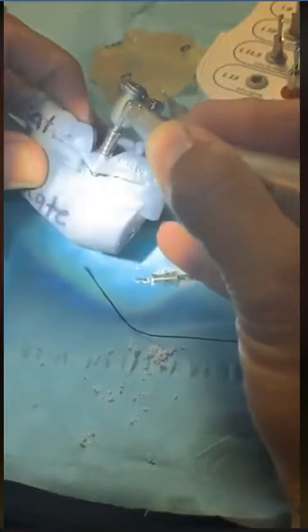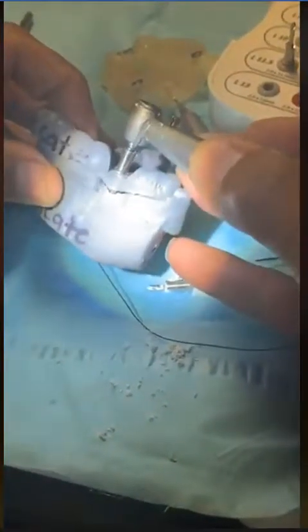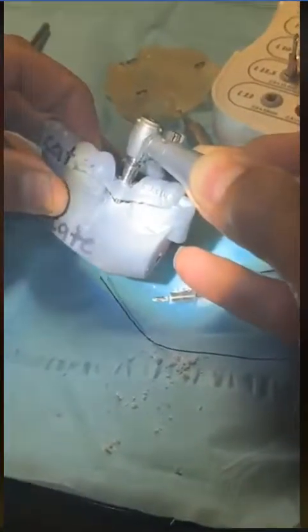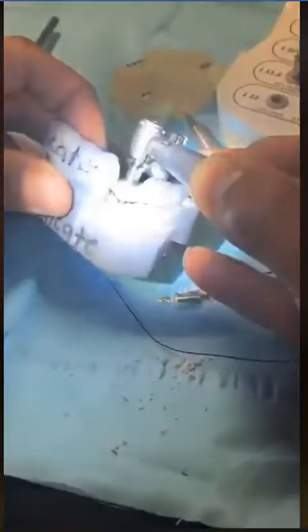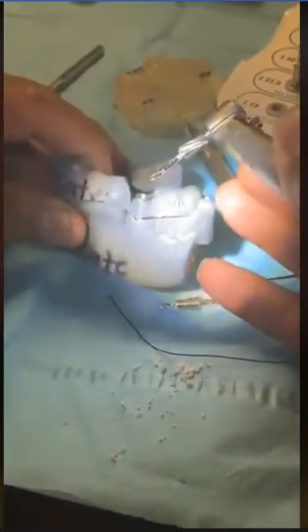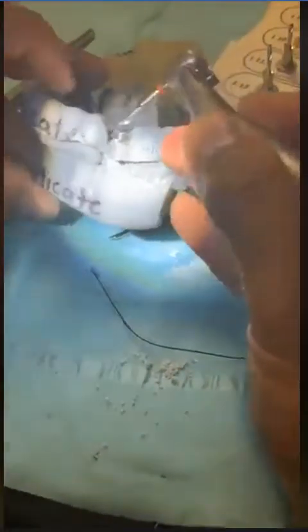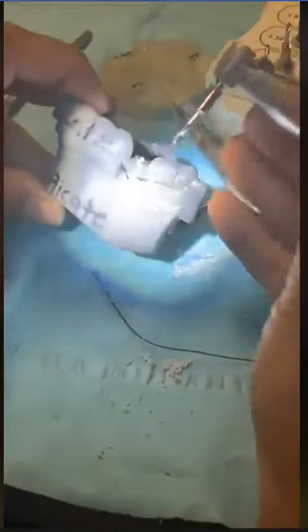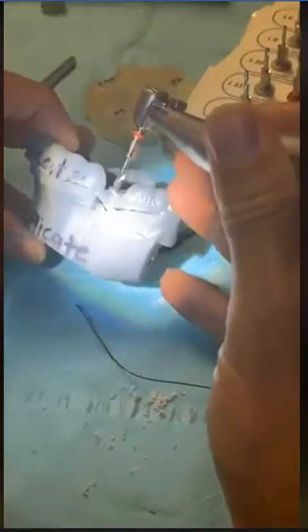Now once that happens, I'm in more and I can engage with the 13 millimeter. Okay? Once you have that, obviously I want you to take an x-ray to make sure everything is good with the patient and you're in the right spot. Always check yourself. Never rely 100% on a guide, okay?